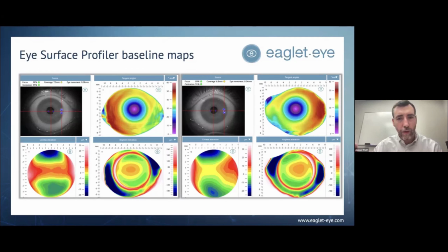So you really just want to focus on getting the eyelids just wide enough for the purposes you're trying to achieve. If you're trying to achieve a corneal lens, you just need the lids beyond the cornea. If you're trying to achieve an intralimbal, sometimes referred to as corneo-scleral type of diameter, well, you just need it a little bit beyond that. You don't need a wide view right there.